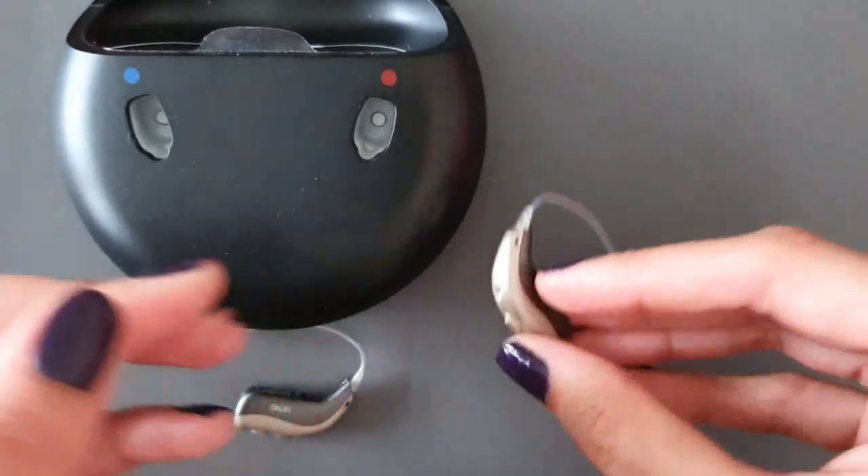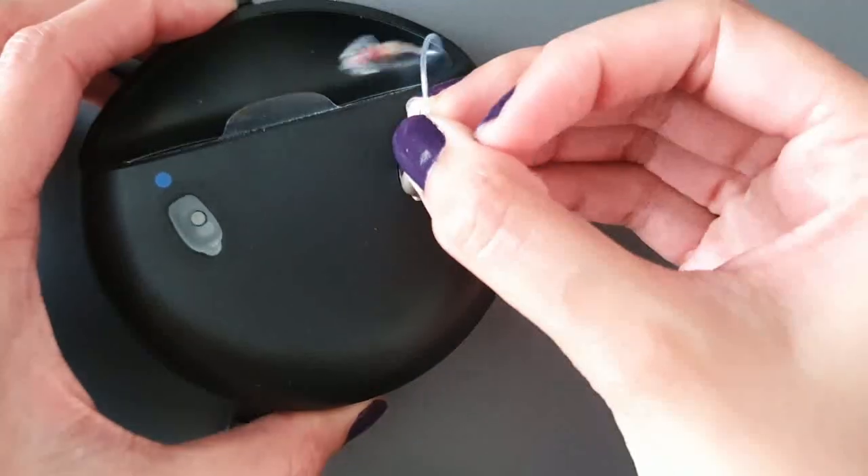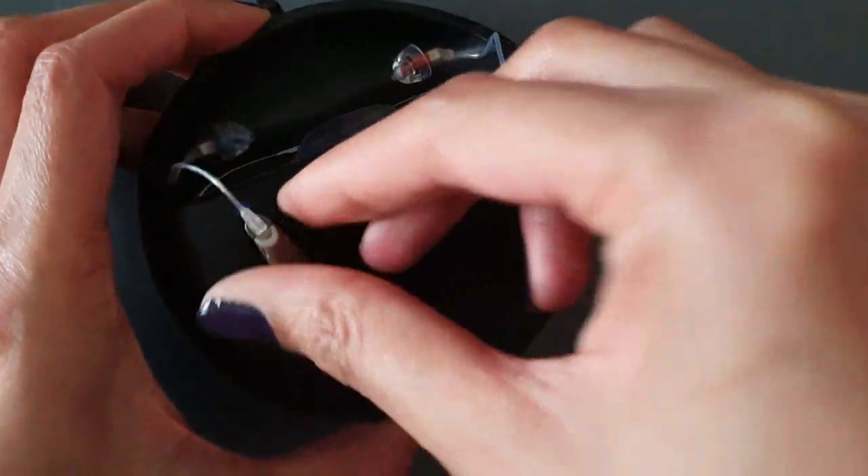So that's how we charge up our Bernafon Viron hearing aids if you have the rechargeable version of the hearing instruments.